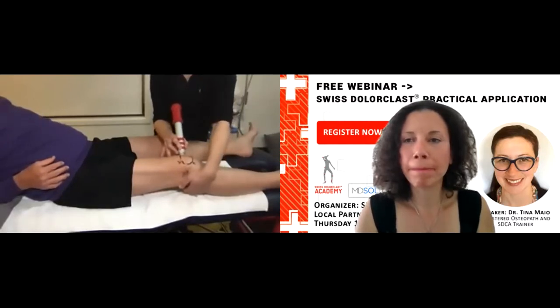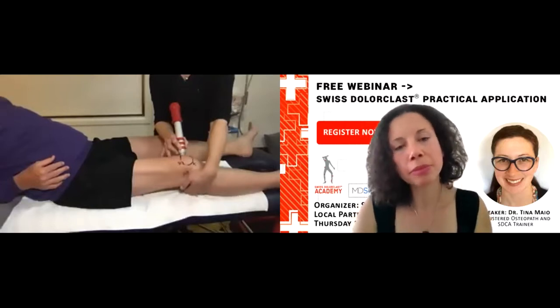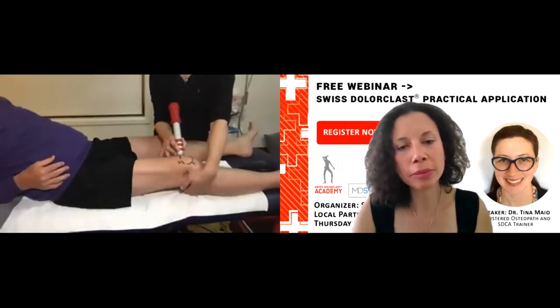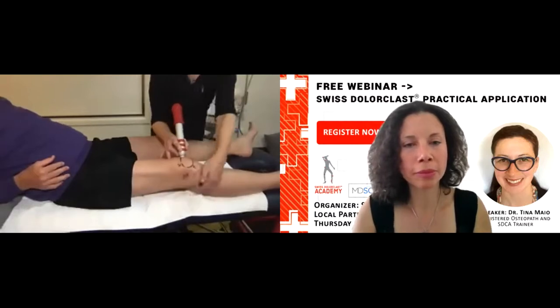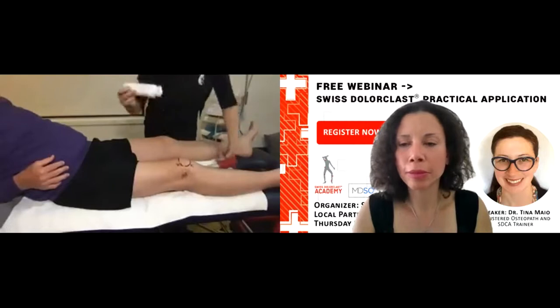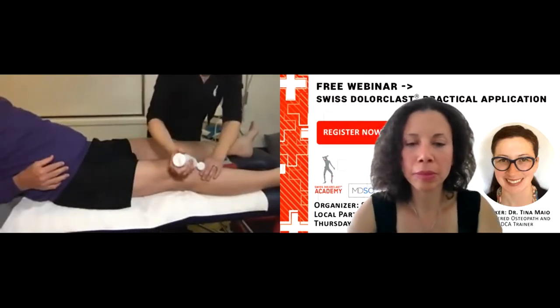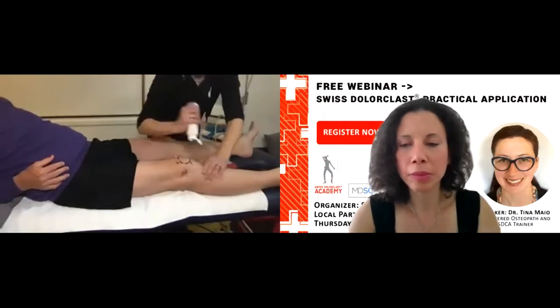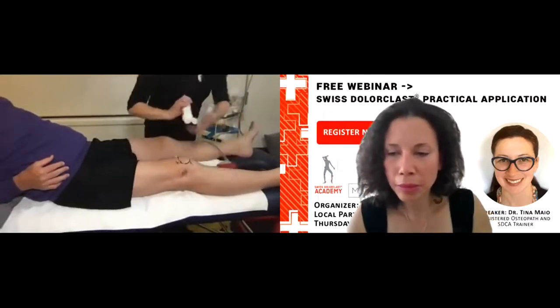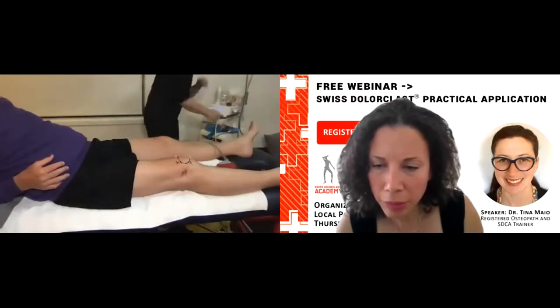So with Mark, the medial side of his knee has more wear than the outside of his knee. So I'm not surprised this side's a little bit more tender. So is that about 500 shocks you've put in? Yep, so I've done about 500 on each side. Because the inside's more tender, I'll probably give it some more.